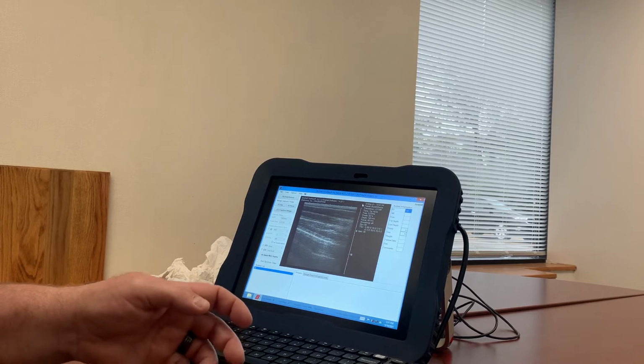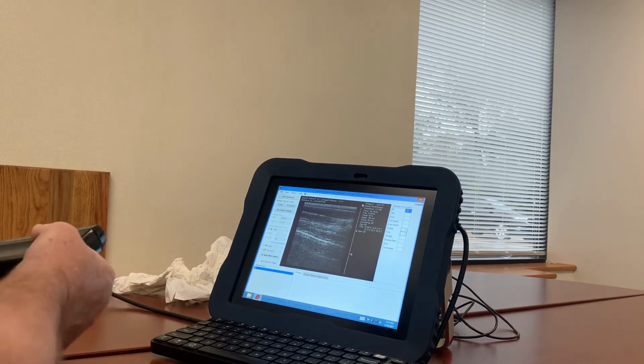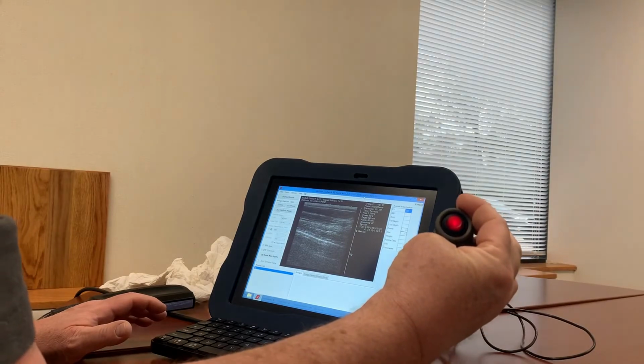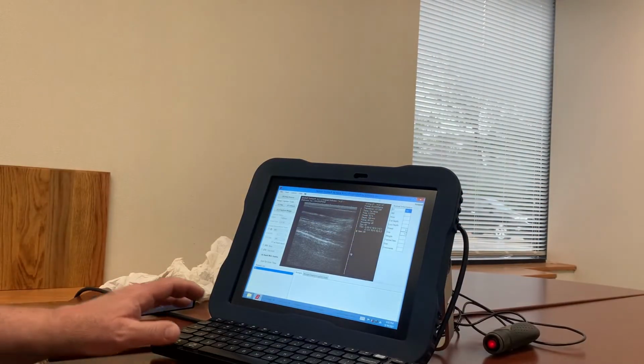And when we have a long enough loop, freeze that. We can either freeze with F or we can freeze with a properly programmed freeze switch. I'll probably just cut my arm over there. You can cut that out.